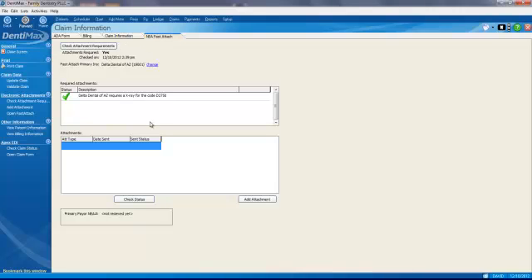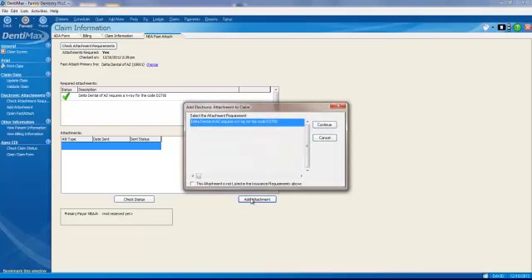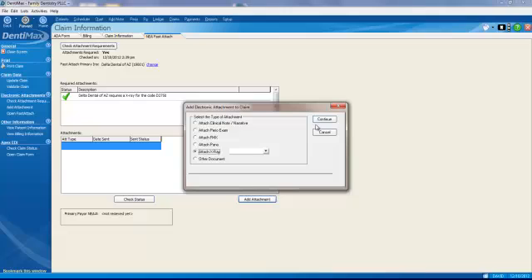So all we need to do is click on Add Attachment here in the bottom right-hand corner, and we'll click on Continue. This is being required for our Porcelain Fused and Metal D2750 code. We'll click on Continue.